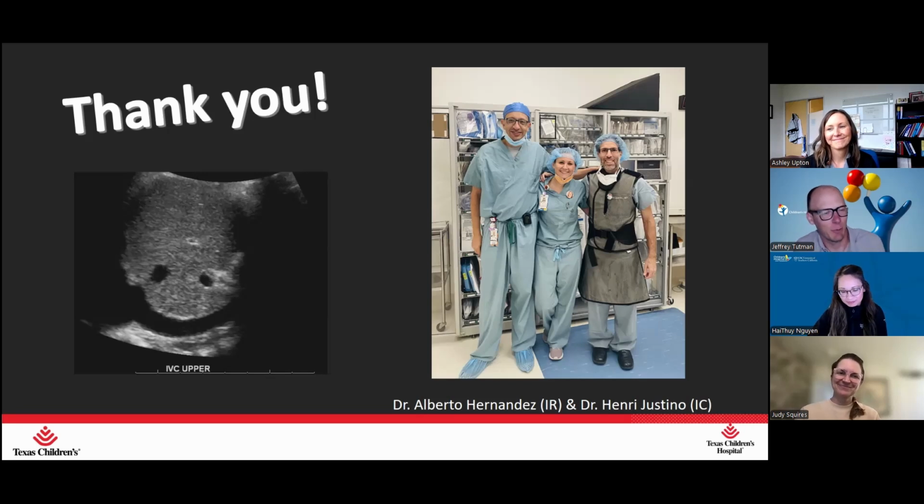I actually did have one more question. I know we talked a little bit about this yesterday, Ashley, but as far as the number of samples you're doing for elastography, I know you had mentioned you guys do 5. We're still doing 10. I know you had mentioned there's some literature that says probably 5 is as good as 10. Judy and Hatchby, are you guys doing 10 samples for a liver elastography, for example? Yes, we are, at least here.